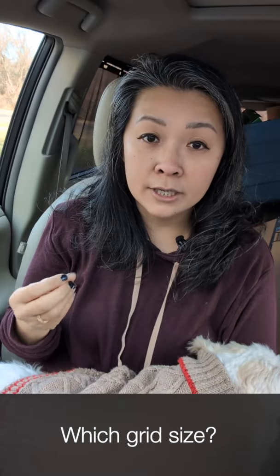Let's do this! Being able to hide and show a button is important because your kiddo might be too distracted with all the options that are on the screen. So there you want to maybe have 3 buttons on the screen, or maybe even 1 button on the screen. Next, how big of a grid should I give my child?